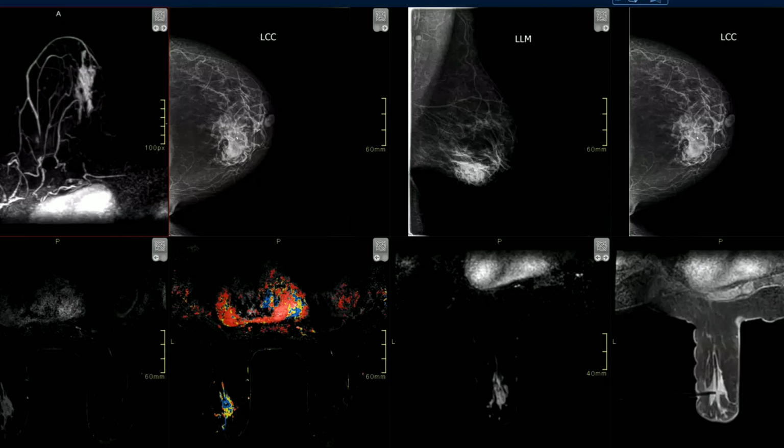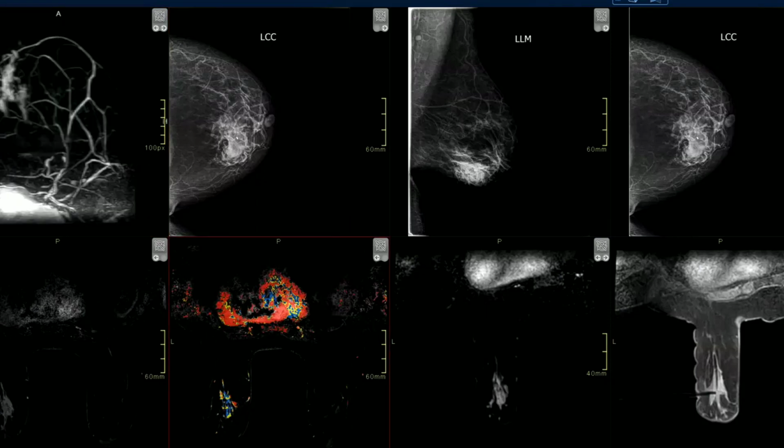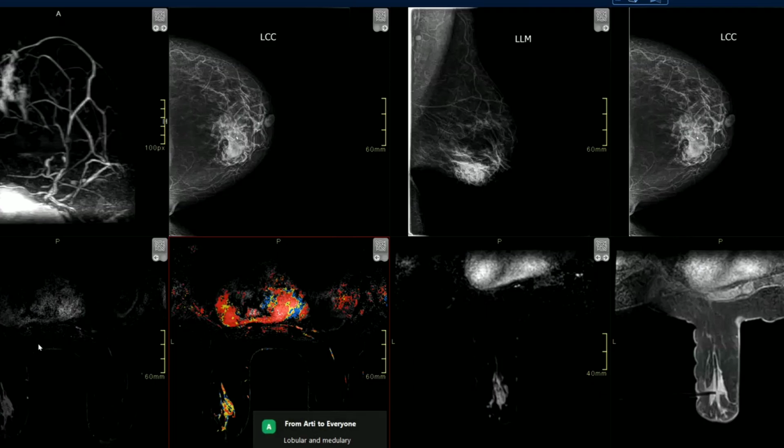So do you know something about stereotactic biopsy? What does it mean? What is a stereotactic biopsy? Okay, so this is her here for a stereotactic biopsy. You can see this here. We positioned her, but you can see the vessels everywhere. There were vessels, so we could not do it.